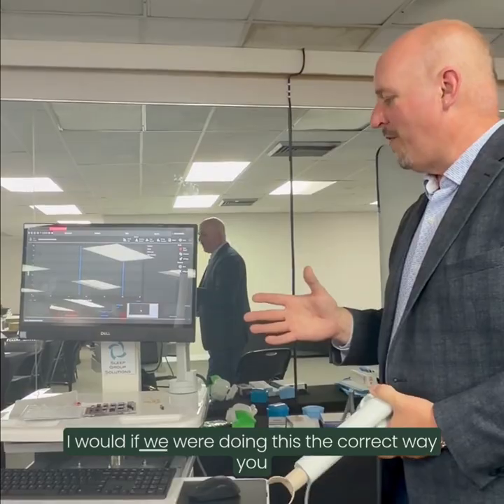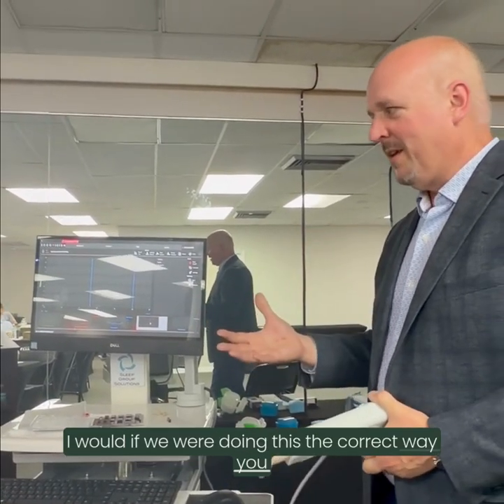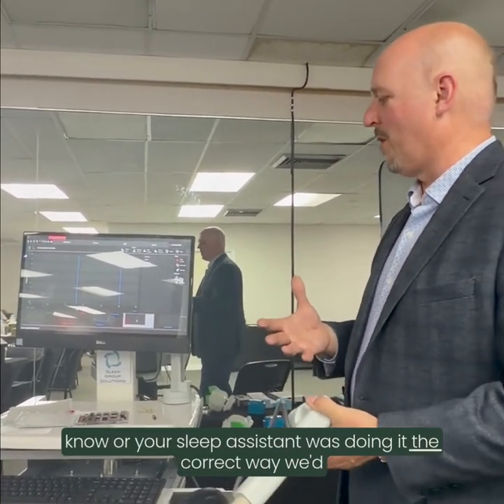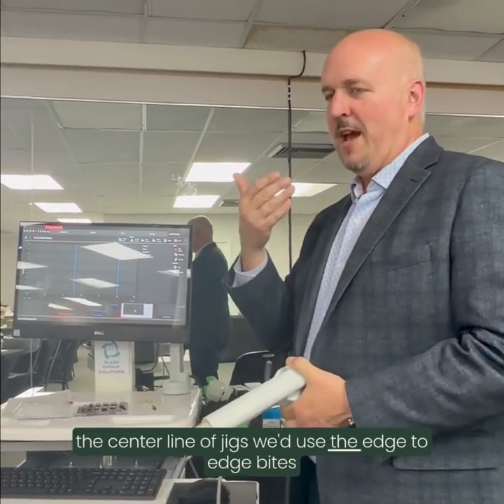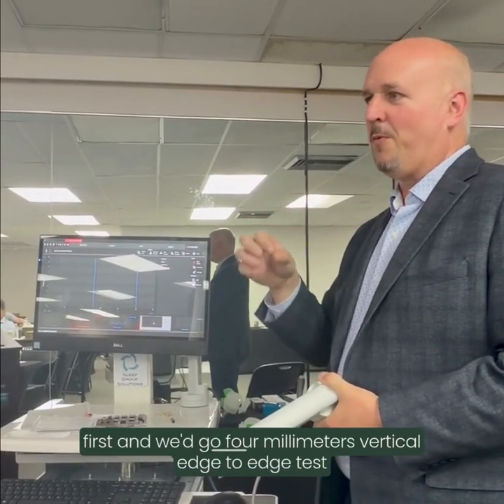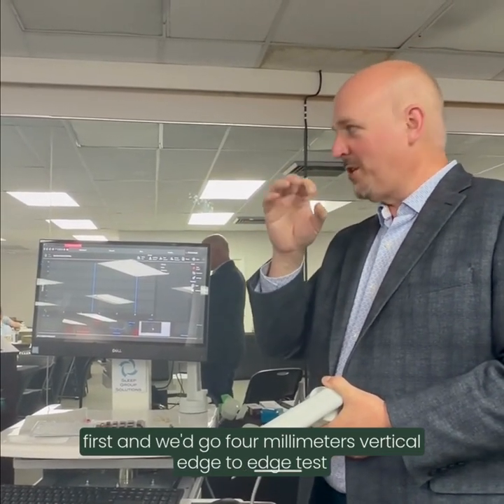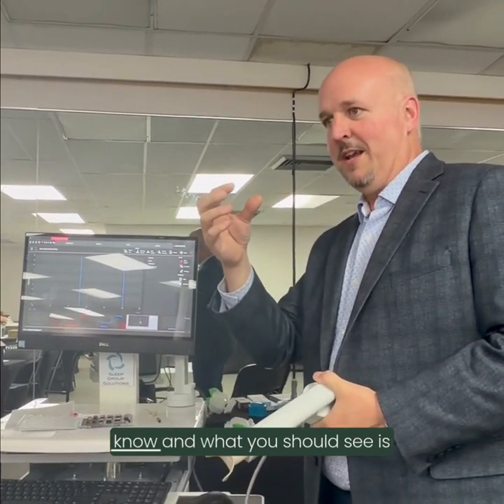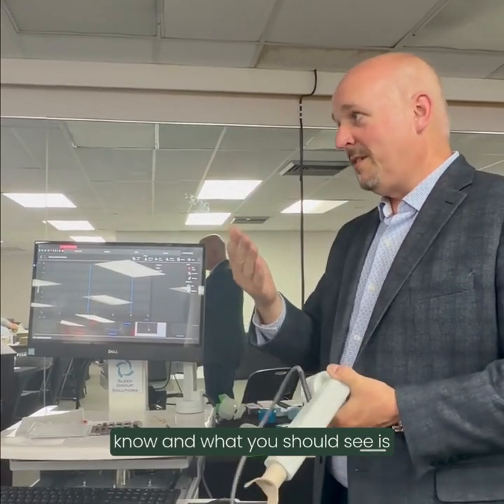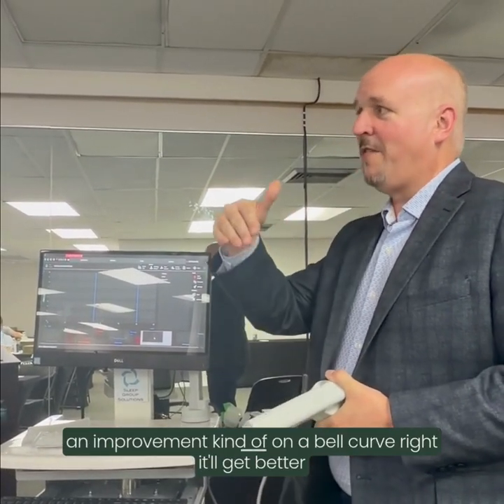If we were doing this the correct way, or your sleeper system was doing it the correct way, we'd use the center line of jigs, we'd use the edge-to-edge bites first, and we'd go 4 millimeters vertical, edge-to-edge, test it, then we'd go to 6, then 8, and what you should see is an improvement kind of on a bell curve.